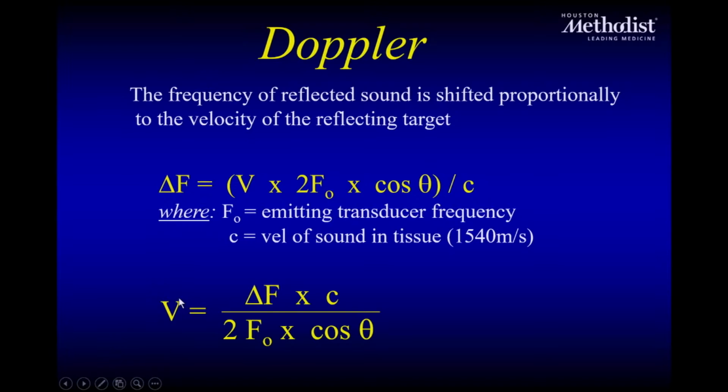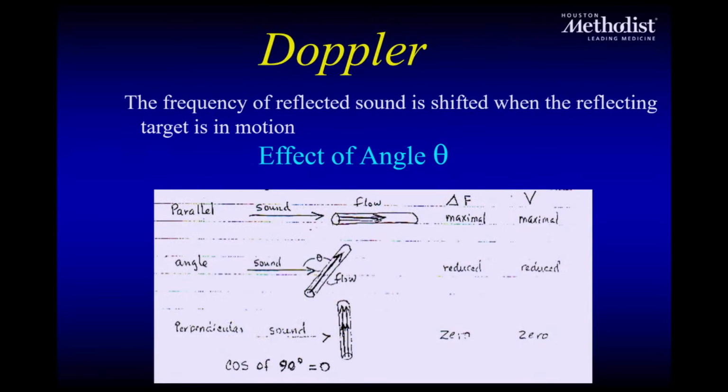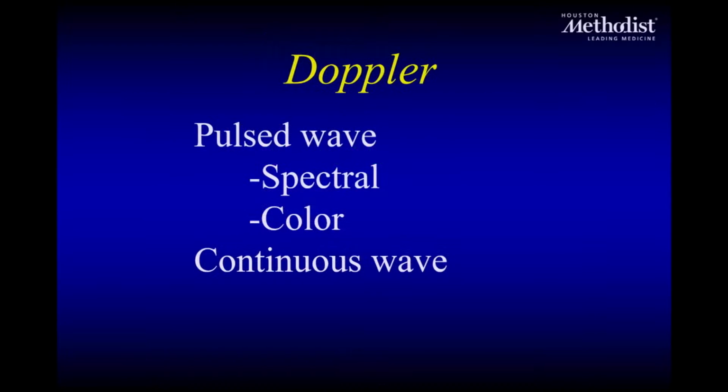But most often nowadays, and actually pretty much everywhere, you will see a velocity scale, and cosine theta is assumed to be the angle of the ultrasound with the motion is assumed to be 0, so this would be 1. Therefore it relates the frequency shift and the initial emitting frequency, in addition to the velocity of tissue and the biological medium. Most of the time it is acceptable if you have an angle below 20 degrees. Once it becomes greater than 20 degrees, I think you will underestimate the frequency shift and therefore the velocity.